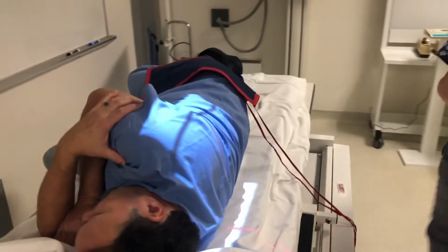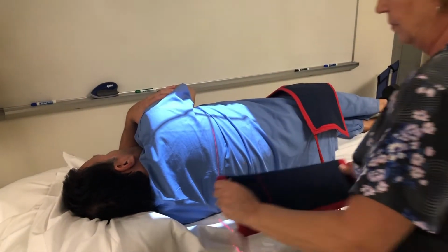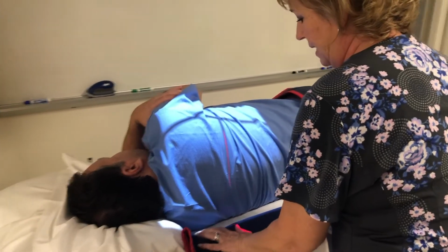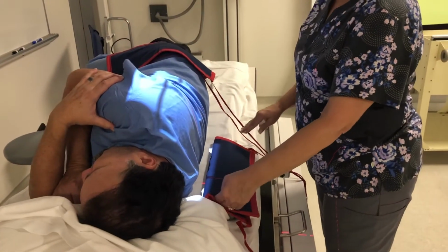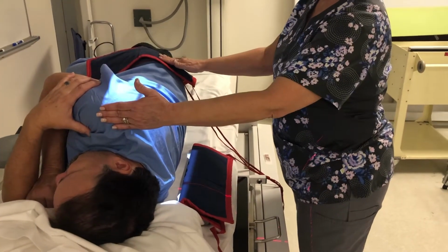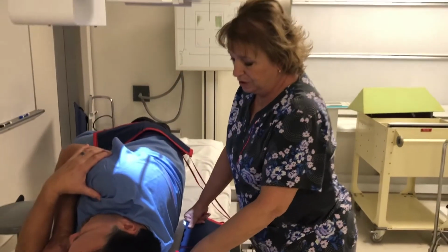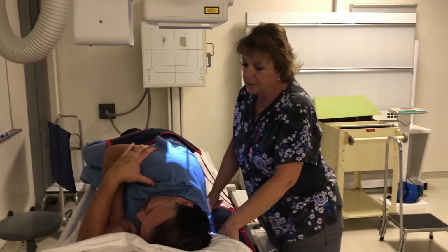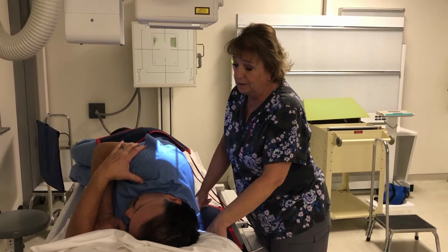I'm going to, again, because we're going through a really thick body part, place a strip of lead behind the patient to absorb scatter, and I'm all set to go. So this particular picture here is going to take about 3 to 4 seconds, and I just want you to breathe normally throughout the entire picture.